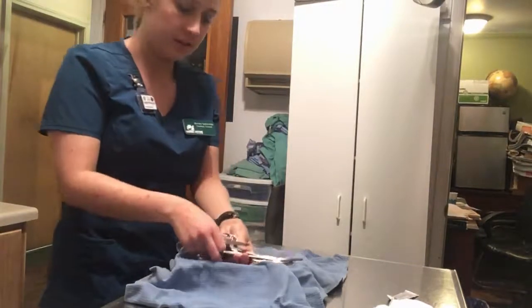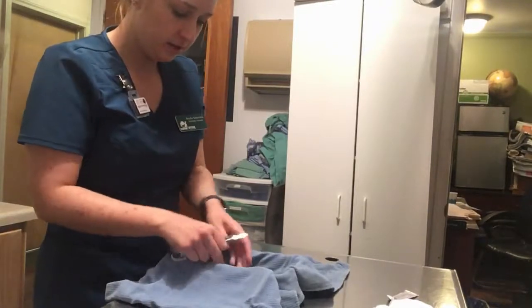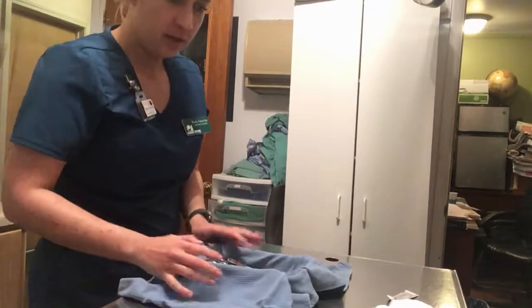Alright, now that I have those, I can go ahead and place them in my pack, as you can see.